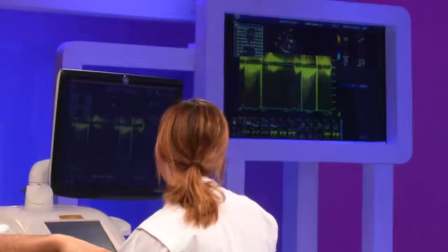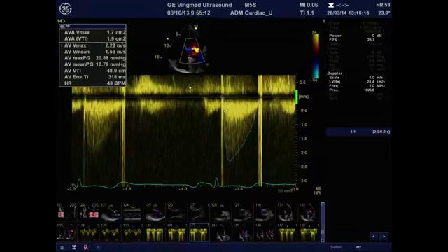And then you realize that we have everything to calculate the effective area surface as we measure the LVOT dimension and we measure the LVOT VTI and here the AV VTI. And using all those parameters, you calculate the aortic valve area of 1.9. And when you do this, it's really important to compare that value with the reference value that you can find in references articles. And for a carbomedic number 25, the reference value is 2 centimeters square. So you are in the normal range for that kind of prosthesis.